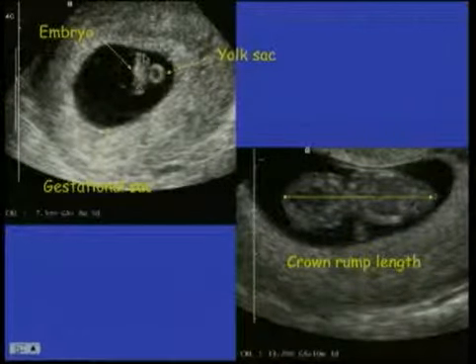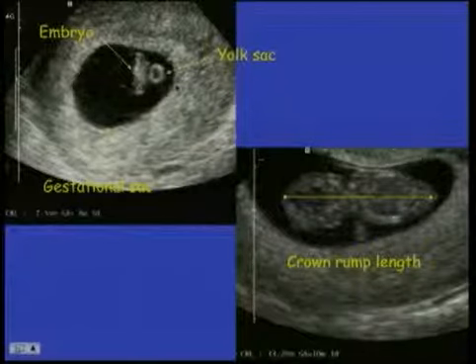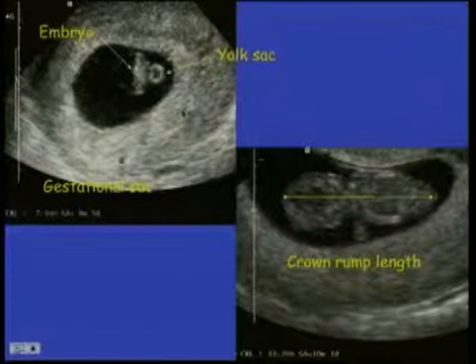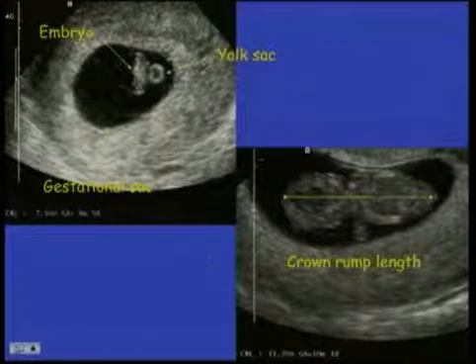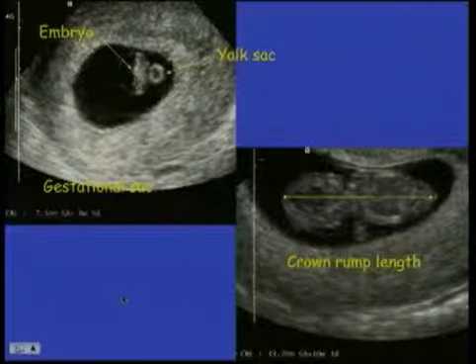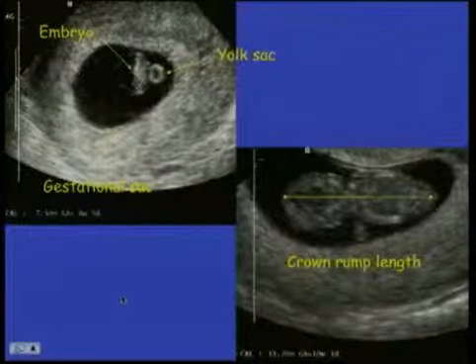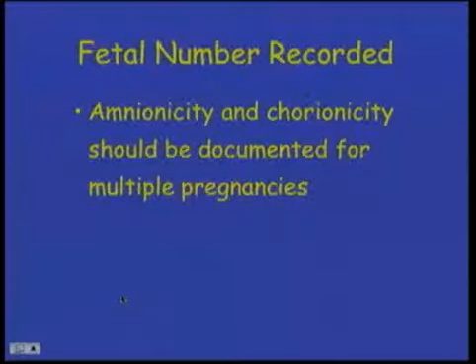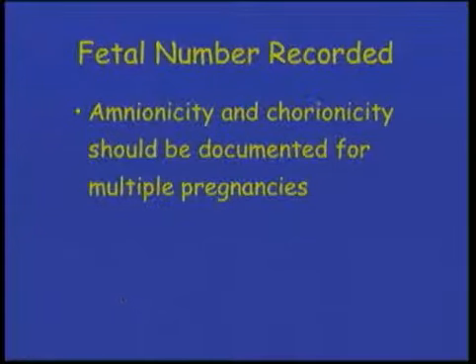Here's a gestational sac — you can see the crown rump length here, the yolk sac to the right, and this is the gestational sac. Here we have a measurement for the crown rump length of the embryo that measures 33 millimeters.